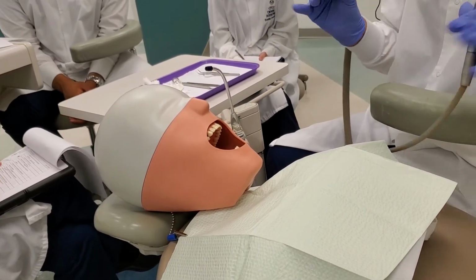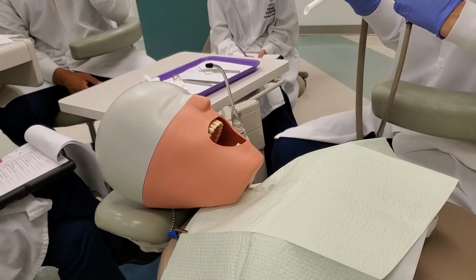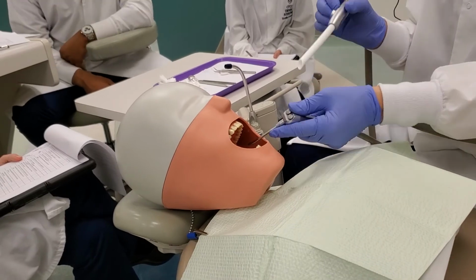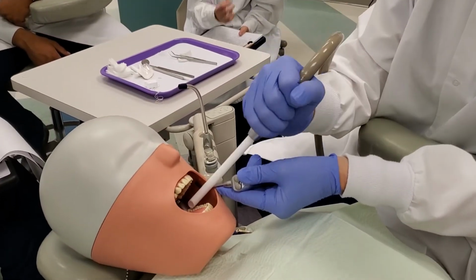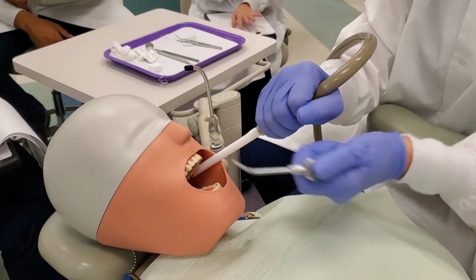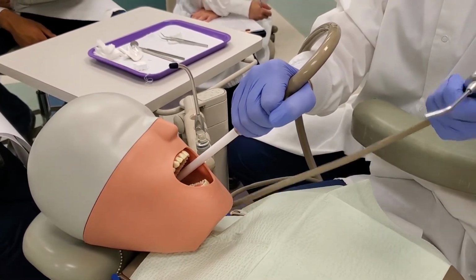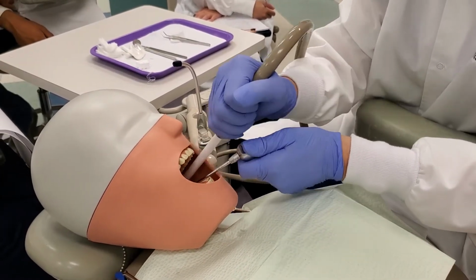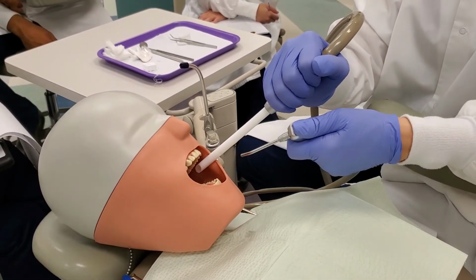But if it's just a limited rinse, so what you're going to do is you're going to come in. If we're going to do a limited rinse for number 14, then you're going to retract. Since it's retraction, it's in that palm grasp. Come in, place it, and it's going to be a limited rinse. It's going to be air and water together, okay? So you can come in, up to the midline and back. You're not moving this, okay? Because the water is going back to the back of the throat.